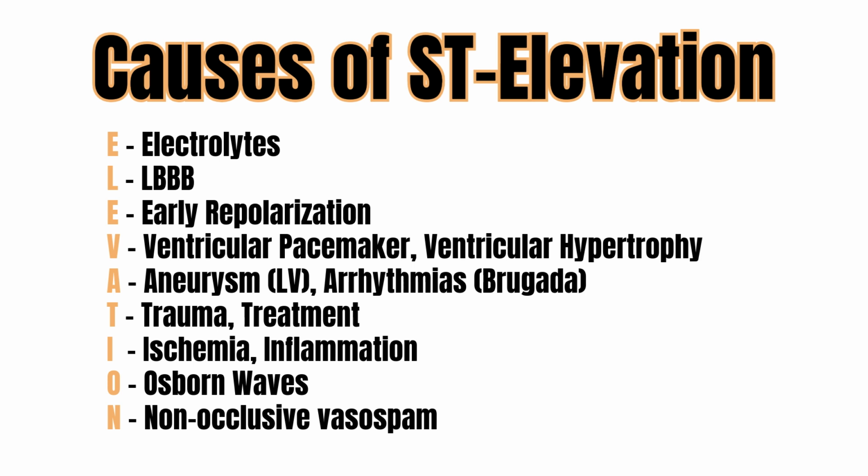All right, so we've worked our way through the elevation mnemonic. That should just about cover everything that causes ST elevation.